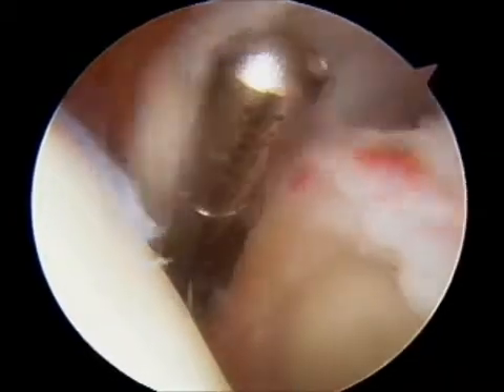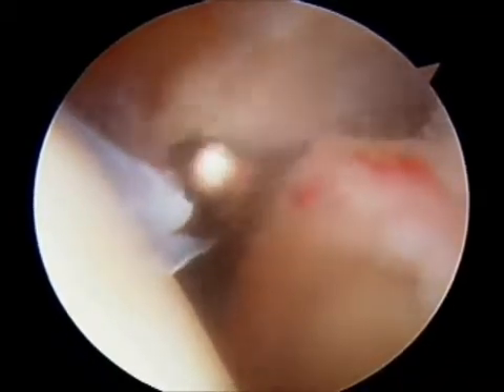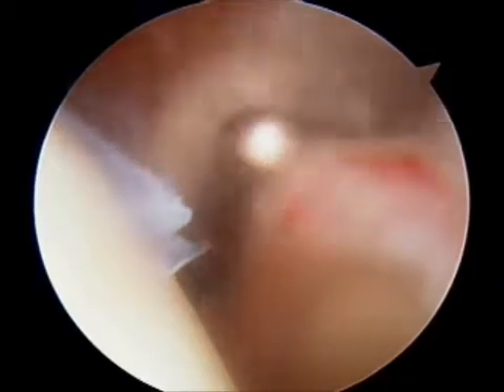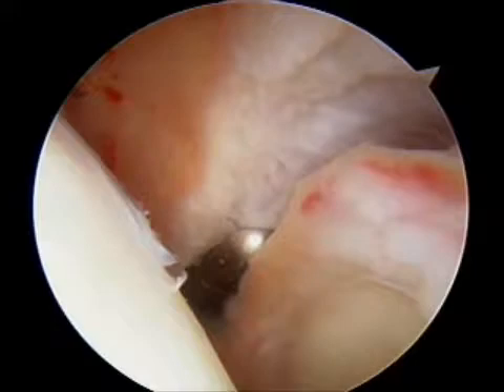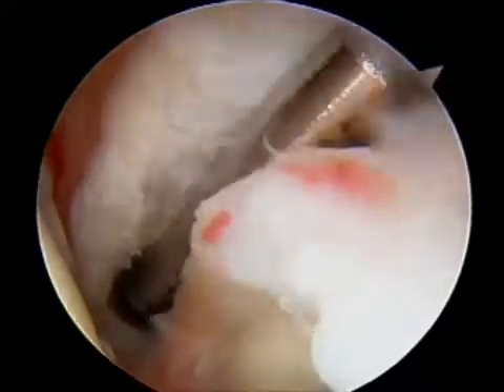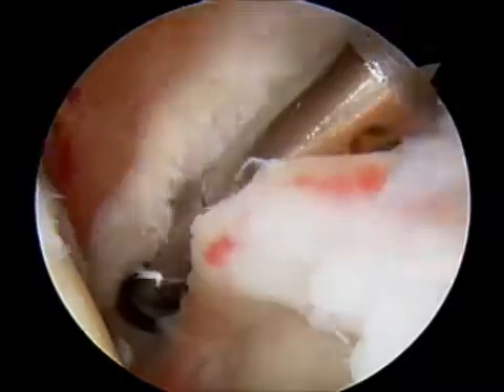At this point in the video, a shaver is being brought in to complete the capsular release. The scissors have cut most of the ligaments and the shaver is going to remove the final aspect of the ligament and reveal the underlying rotator cuff muscle underneath the ligament.